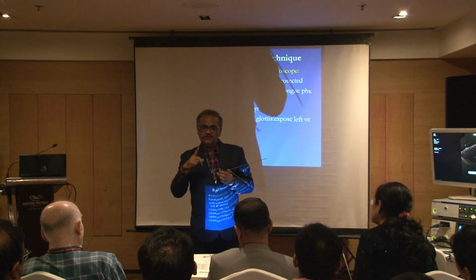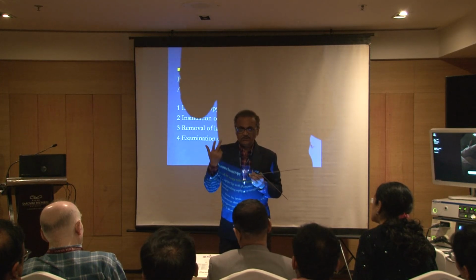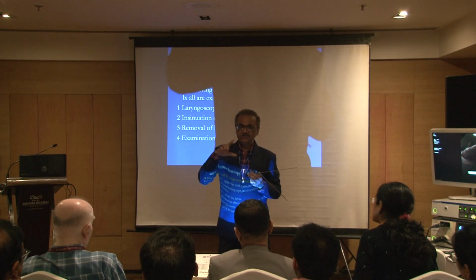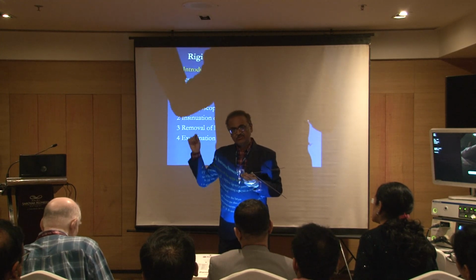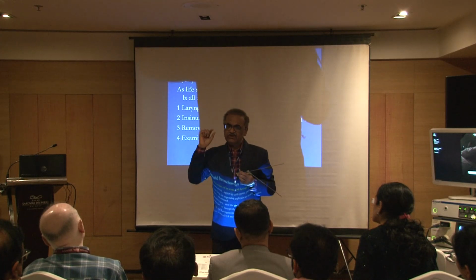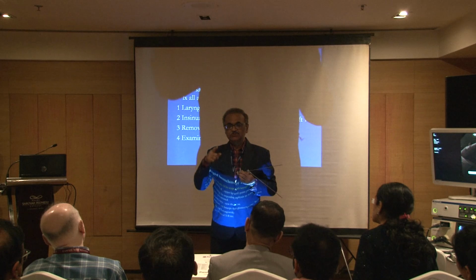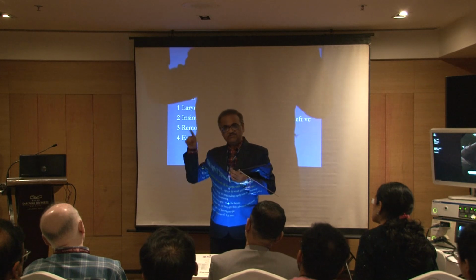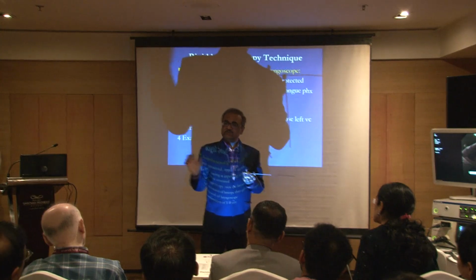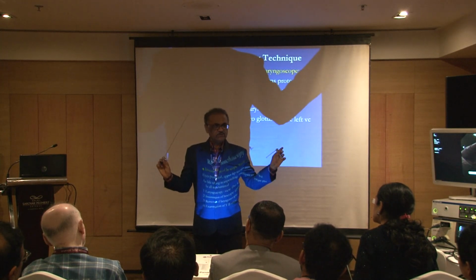So in a given patient, you are doing scopy 3 times, or 2 times minimum. Inspection, secretions, aspiration, looking for foreign body and preparing. Then extraction, removal of foreign body and completely getting out. And one more time you are just going to see whether bleeding is there, aspiration is there, double foreign body is there, remnant is there, and then the procedure is out. Okay. So is there any doubt about this?